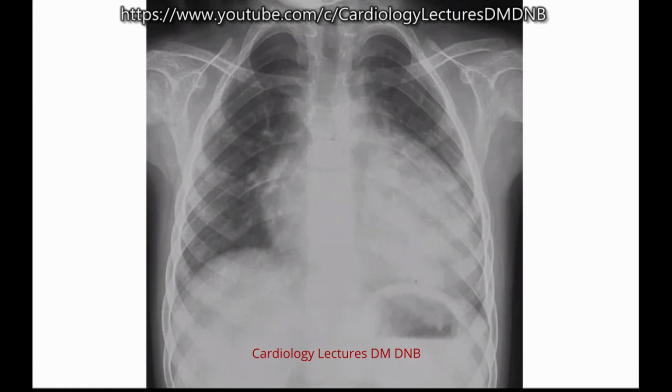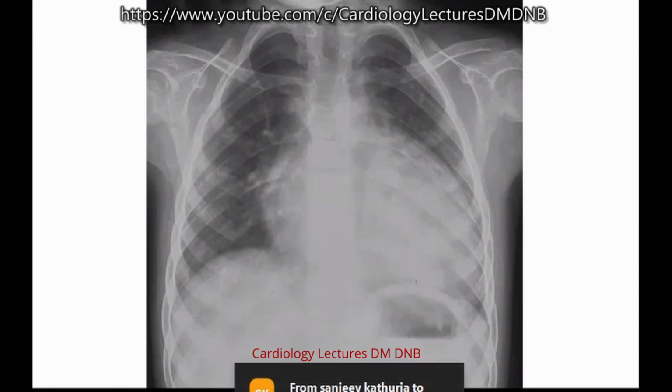Okay, go ahead. And pulmonary bay? Sir, pulmonary bay is not full. So what does that mean? Pulmonary artery is not enlarged, so there is no post-stenotic dilatation. Yes, sir, there is no bay also. So how do you say that? Sir, in valvular pulmonic stenosis, patients have post-stenotic dilatation, but in dysplastic valve, they have normal size pulmonary arteries or hypoplastic pulmonary arteries. So this might be the reason. Okay. What else? Comment on the vasculature.